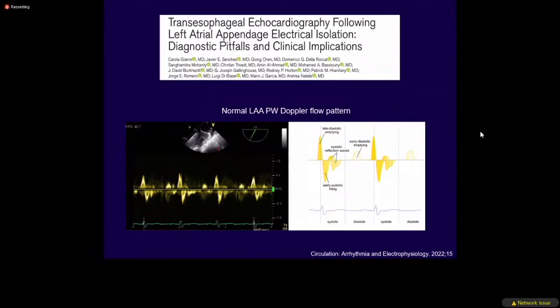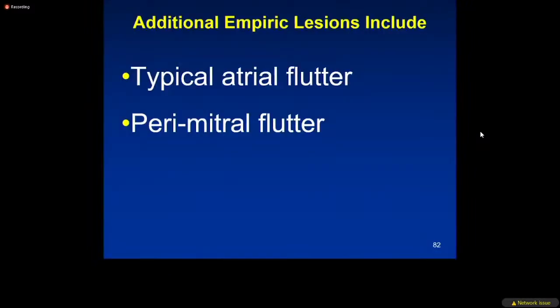And it's very simple. You just need to make sure that whatever the people are measuring is after the P wave, between the P wave and the end of the QRS. Everything else in the middle of the diastole is irrelevant, that's passive.